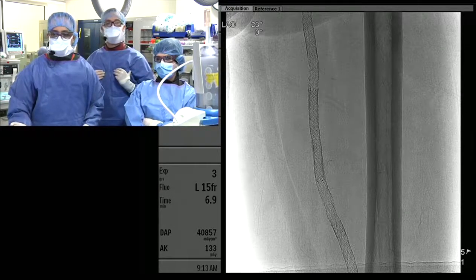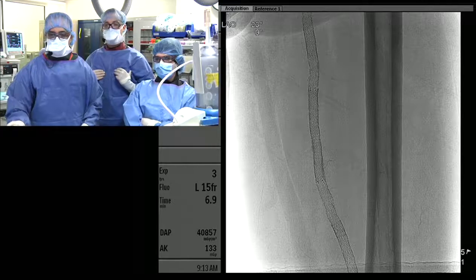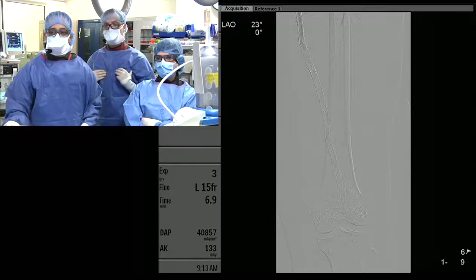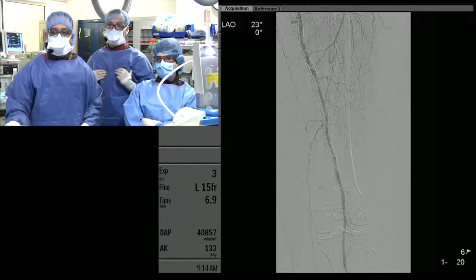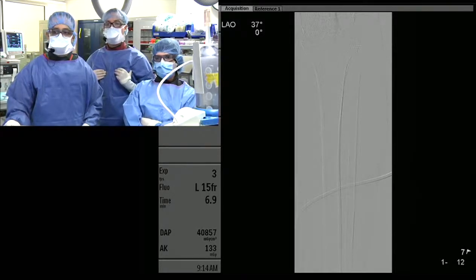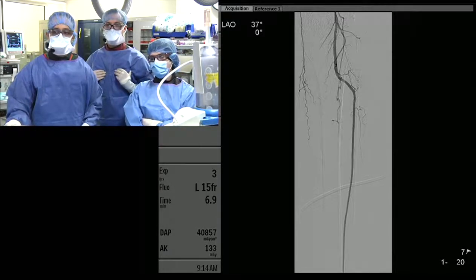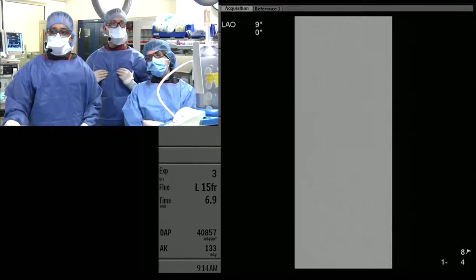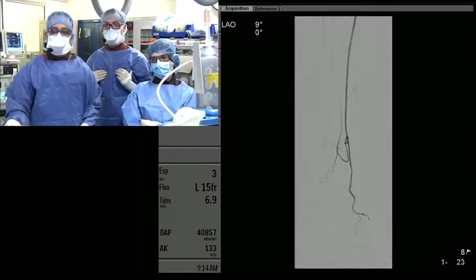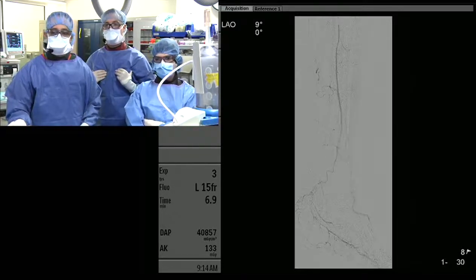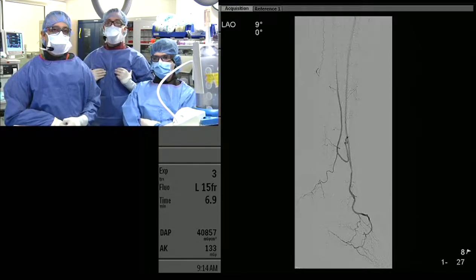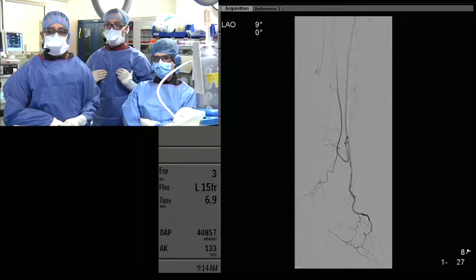You can see the old stent fracture, but the new stents are through it, so that's not really an issue. We did the runoff all the way down to the foot, which hasn't changed much — she still has single-vessel runoff via the anterior tibial into the foot. Our plan today is to try angioplasty of this area, and possibly DCB.